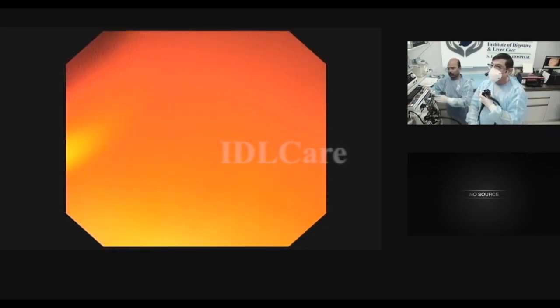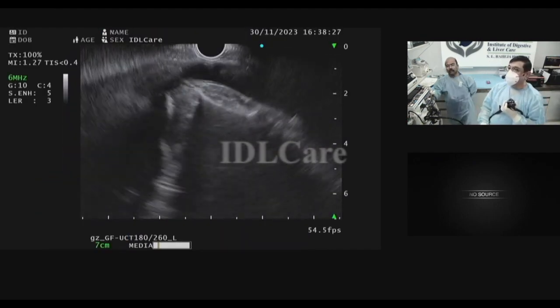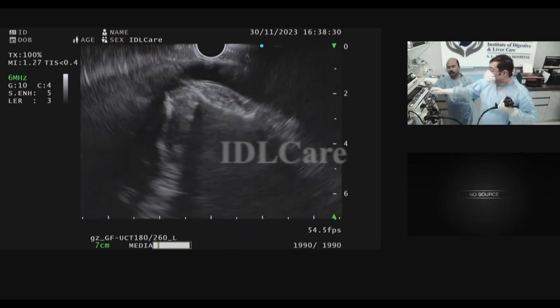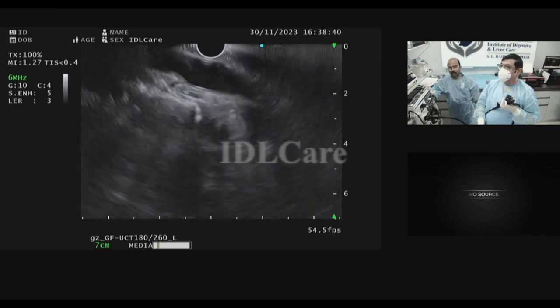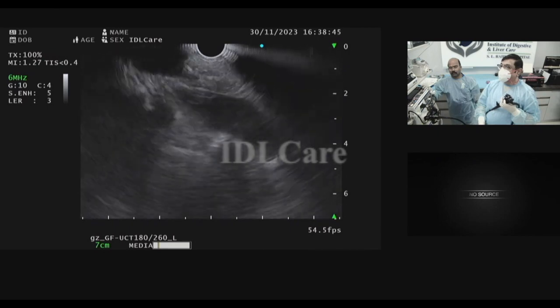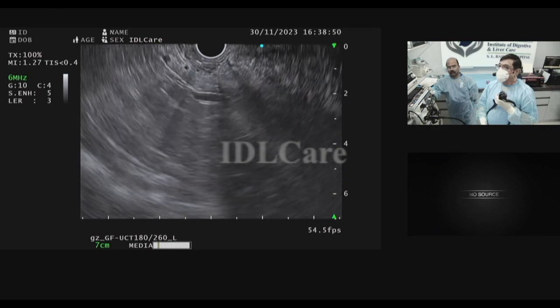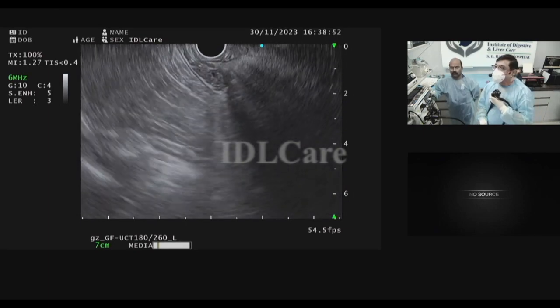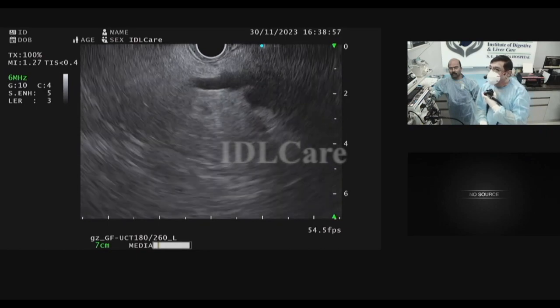We shorten just like ERCP, turn anti-clockwise, and here you see the spine, please. This is the spine and the aorta, please. Come back, come back, come back, and withdraw. And now I start doing up and clockwise, and that should bring the pancreas in view. I am doing extreme clockwise now. See, this is the extreme clockwise, and you see the mesenteric vessels.